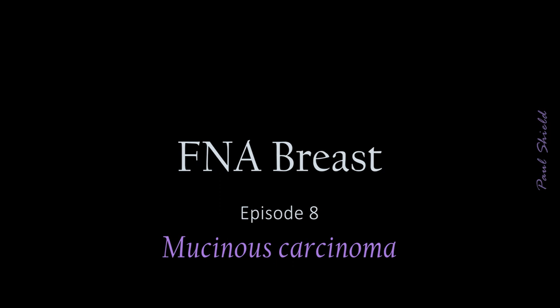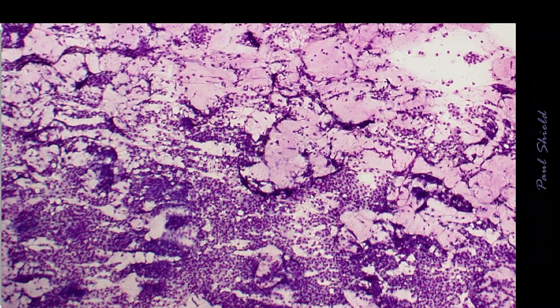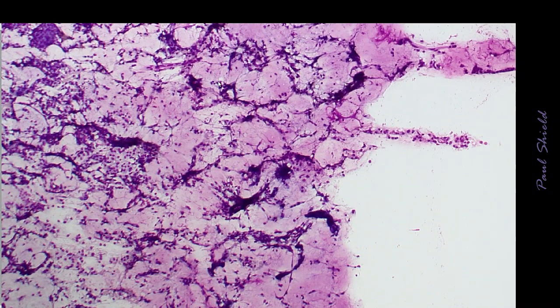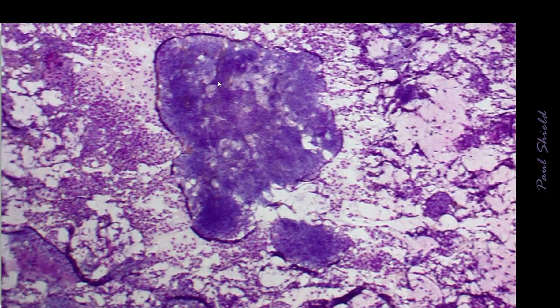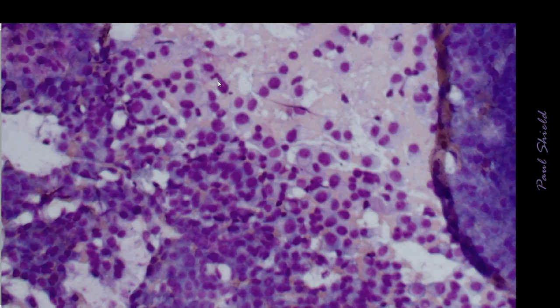This case is quite cellular, a lot of dispersed cells that seem to have cytoplasm in the background, and then also quite a lot of background material which is staining magenta, which was mucin. Also noticed crisscrossing through that mucinous material are branching blood vessels. As well as dispersed groups, we've got more rounded groups that are a little more cohesive. It's quite a thick specimen.